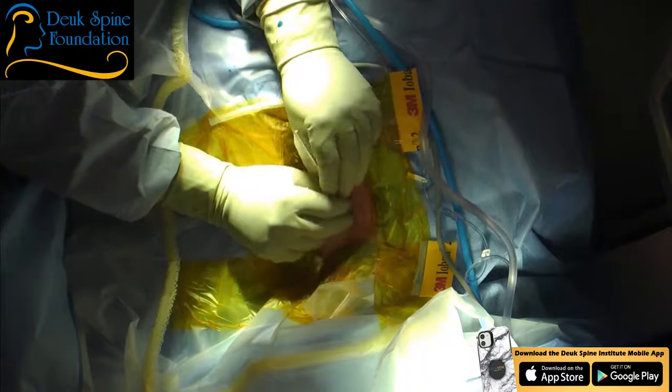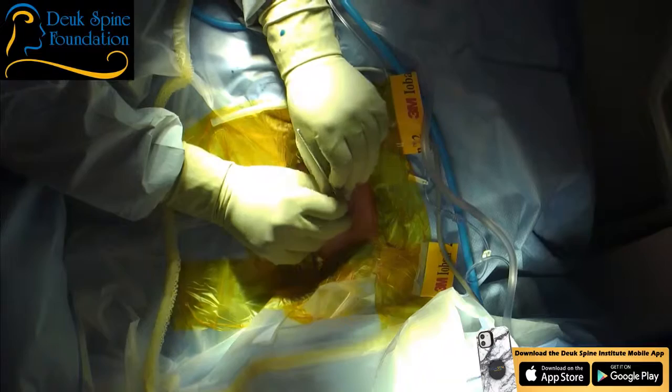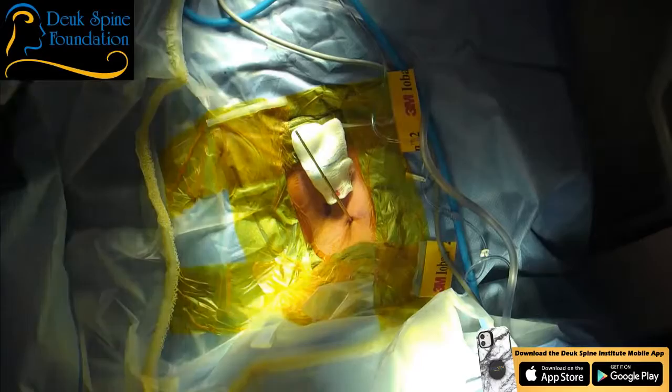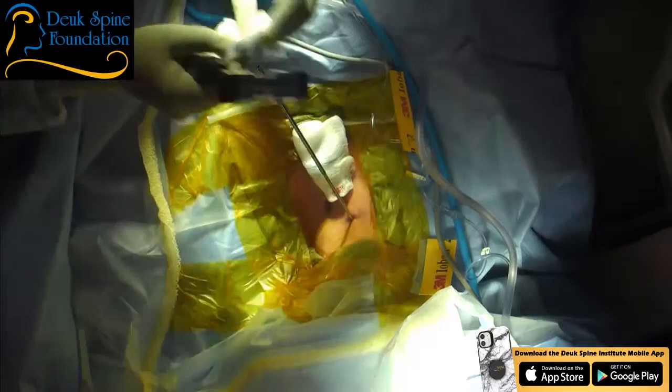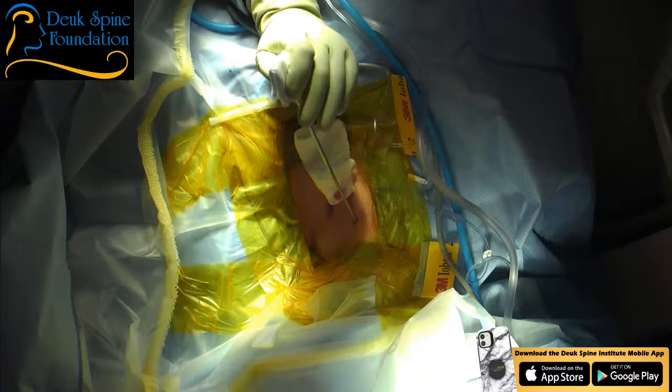So why does she have right arm pain — what we call cervical radiculopathy? Because the nerve is being crushed by a big herniated disc. It's a piece of disc material that shot out through a tear in the back of the disc, and now it's pressed up against her nerve root. I'm going to go get that herniation out, but I don't want to create collateral damage. I want to advance this tubular retractor without advancing the dilator.